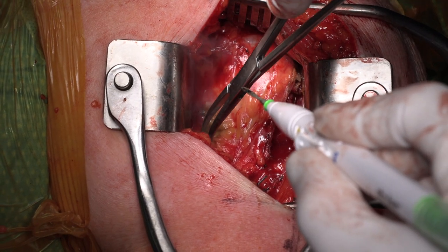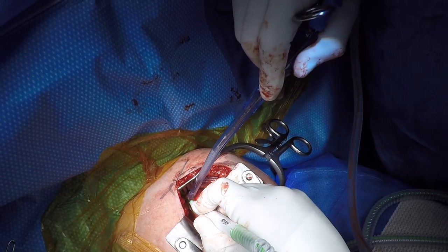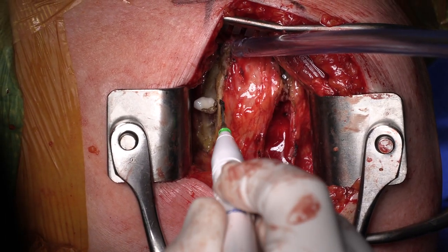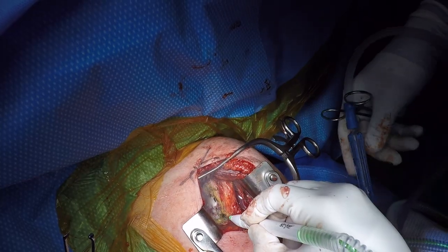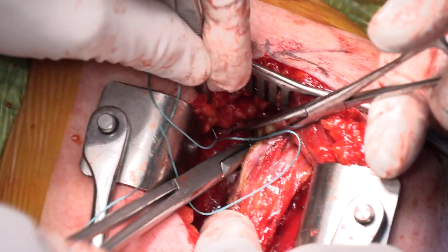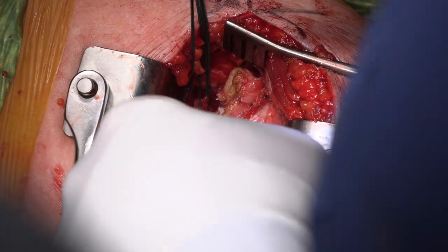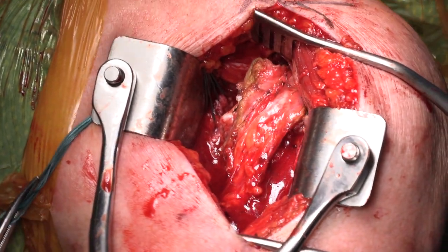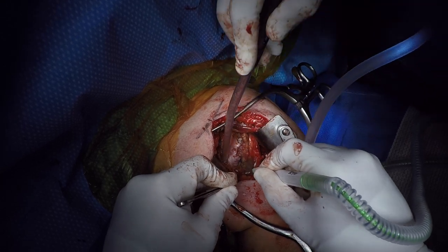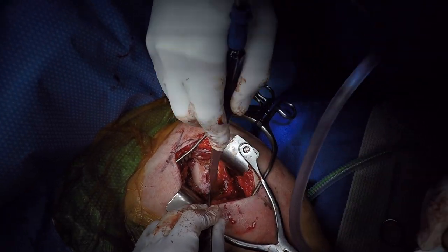The subscapularis insertion into the lesser tuberosity is identified along with the rotator interval. The subscapularis tendon and associated capsule are divided 1 cm medial to its insertion into the lesser tuberosity to allow adequate tendon laterally for later repair. The edge of the subscapularis tendon is tagged with number 2 non-absorbable braided sutures. The rotator interval is then divided to the anterior superior glenoid. The humerus is externally rotated and the capsule is detached from the anterior inferior aspect of the humeral neck to the posterior inferior corner, allowing the humerus to be externally rotated to 90 degrees.